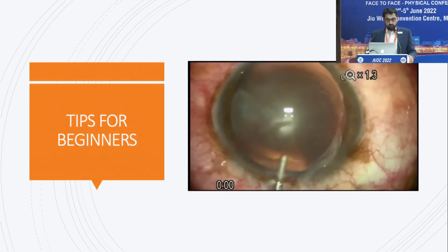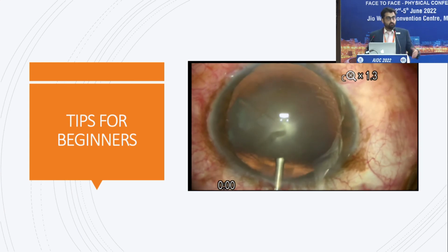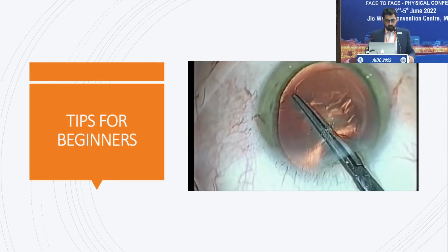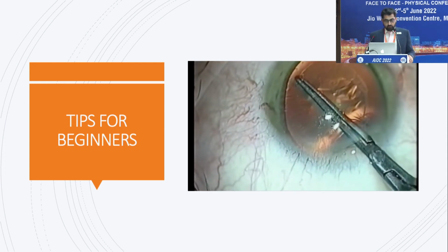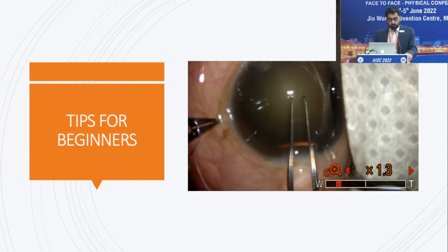Another thing is, whenever you're injecting your viscoelastic, remember, you don't need spaghetti, you need to coat it. A lot of us just spray the viscoelastic like a spaghetti or a noodle, and that's not what we desire. For good control, like sir suggested, you can use a high density viscoelastic, especially in pediatric cataracts or where you expect a run out.